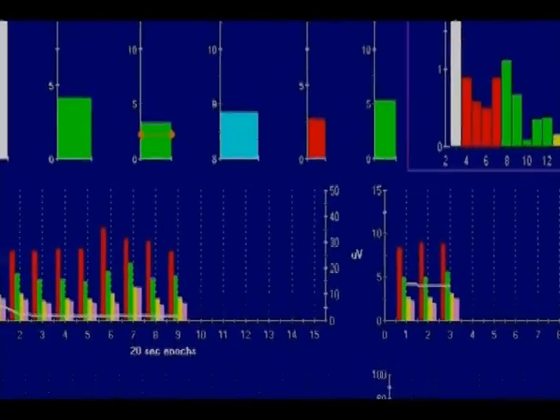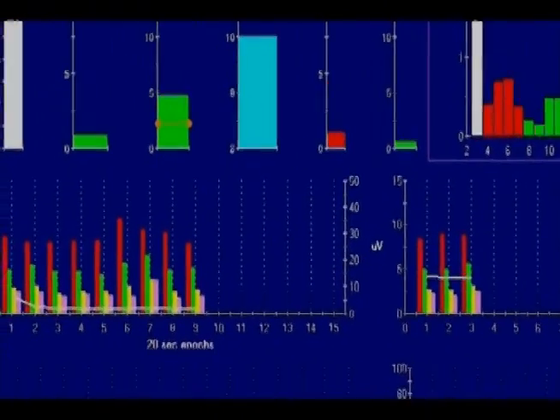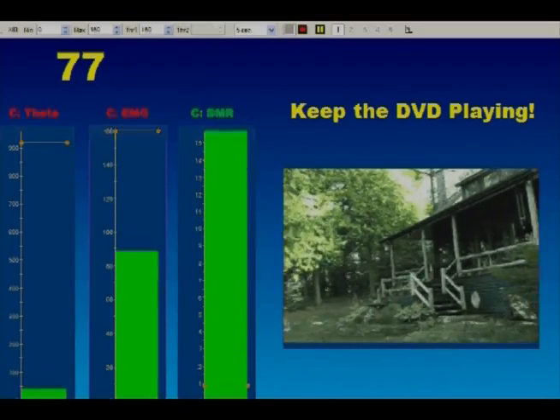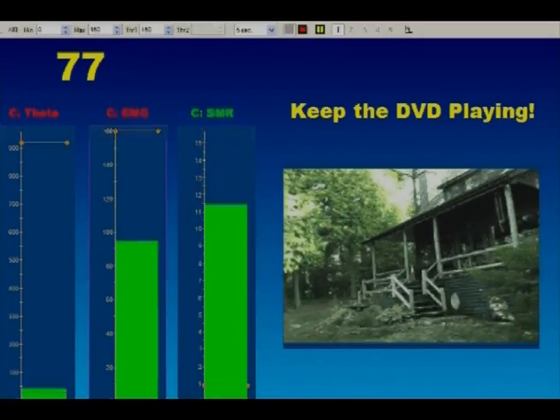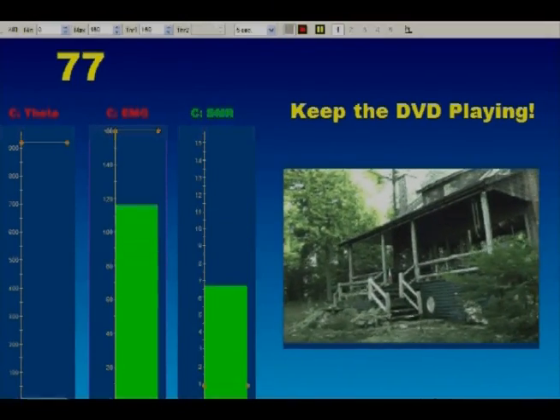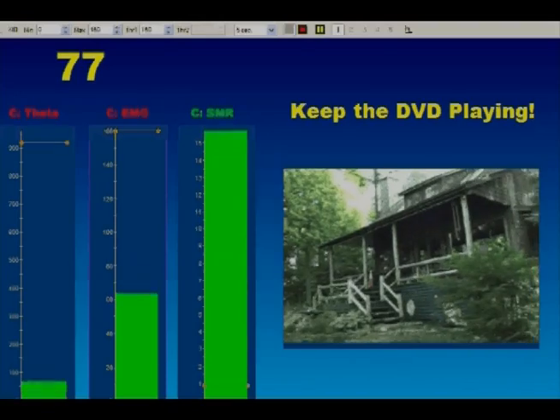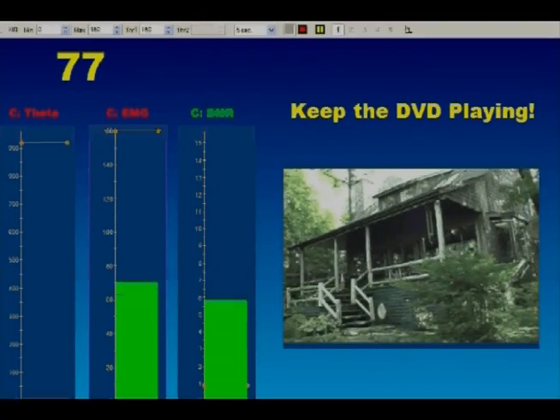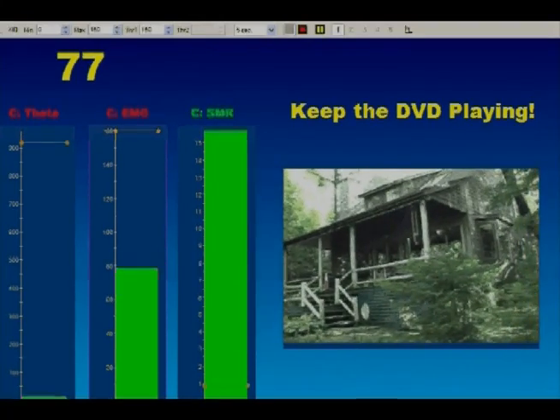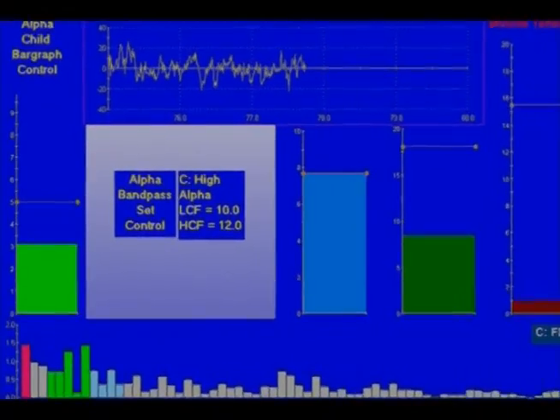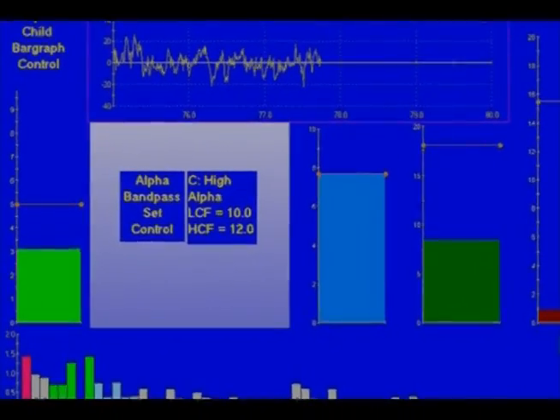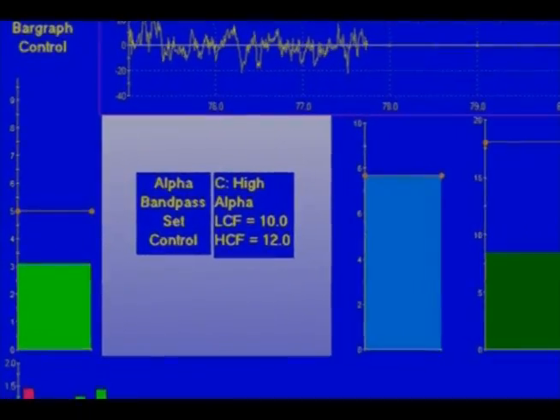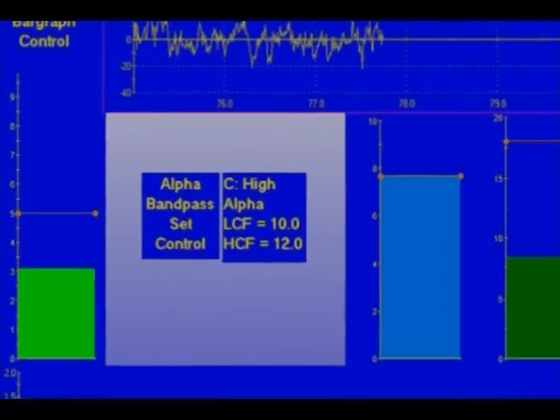This is ideal to review session progress with a client. This screen provides DVD feedback. Aside from stopping and starting the DVD, three other independent controls can be applied, including shrink, zoom, and sound on/off. This is a clinician screen illustrating the on-the-fly ability to change bandpass settings as reflected on the client screen.